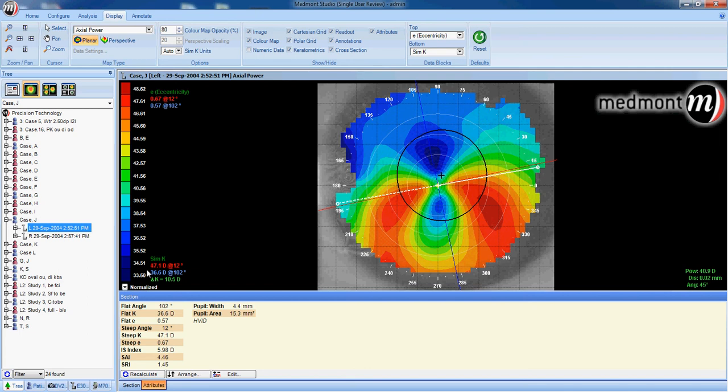We could also look at the scale range, and we go from 33 diopters on the flattest we can read to 48 diopters, the steepest the topographer can read, a scale range of 15 diopters. Normal corneas fall within 10 diopters, so this is an abnormal eye.